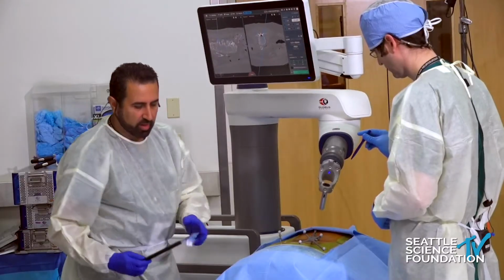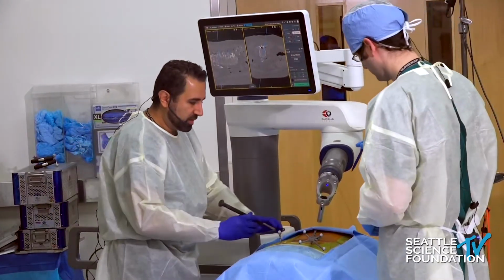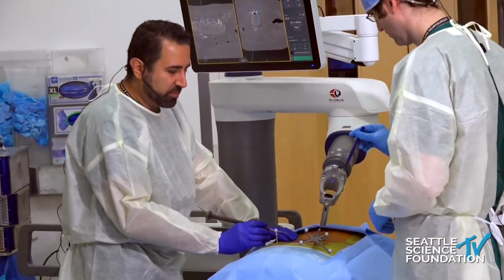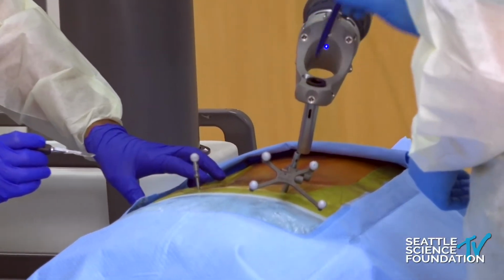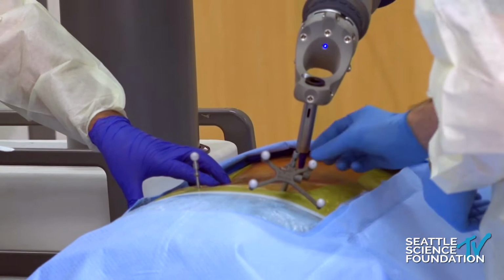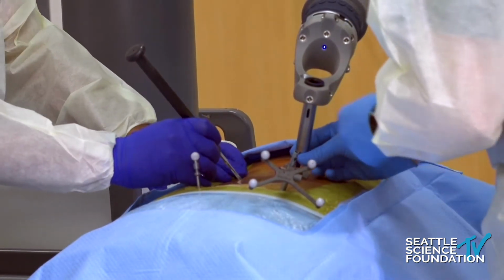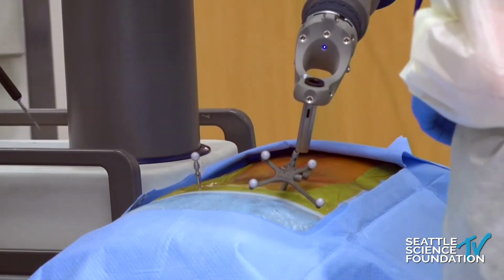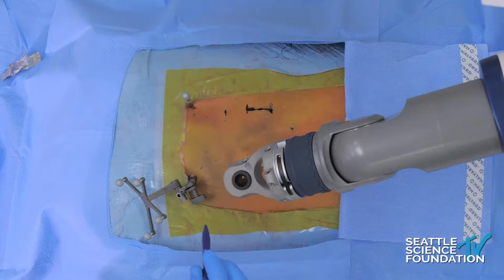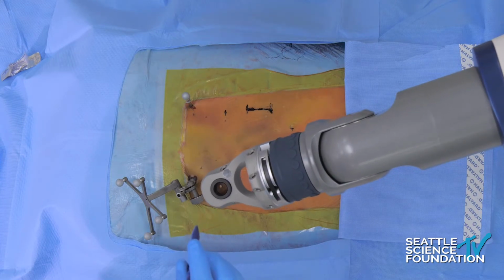To save time, and this is my workflow as well, once I put local anesthetic in the patient, I'm either able to do stab incisions here for true percutaneous screws, but obviously when we have two screws close together, the incisions merge together. So I just do the one incision here. I do a little bit of a bigger incision for allowing the rod placement. So there's your L4 coming into view.